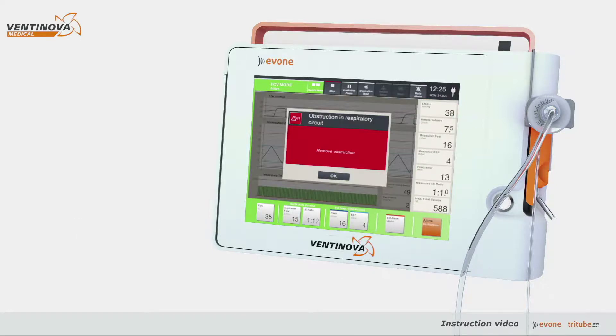Yvonne has several audible and visual high, medium, and low priority alarms, indicating physiologic deviations or technical problems.